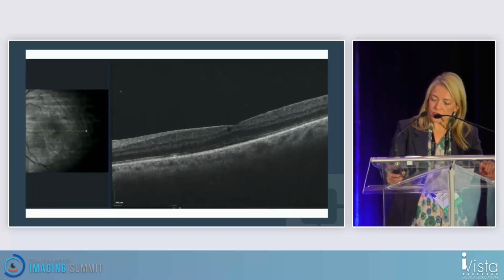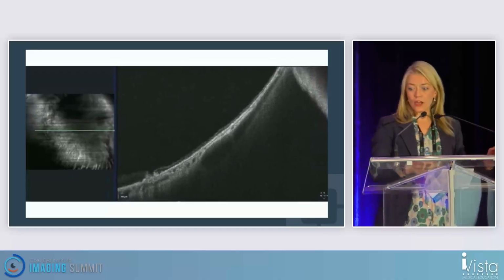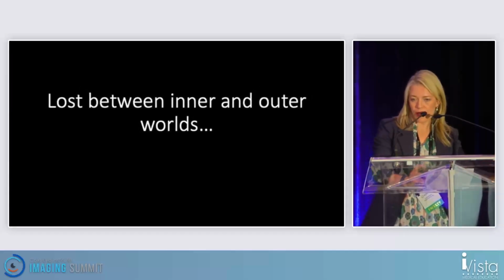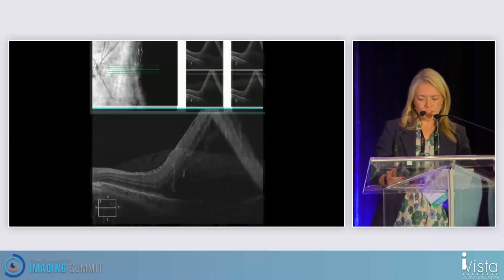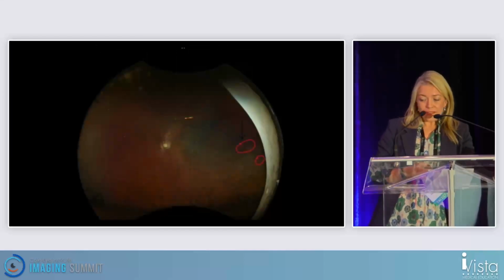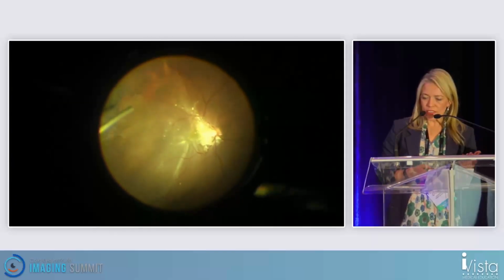This is the macular OCT, and then in the periphery you can see the laser that we did. This is the very thin inner retina where there was a large outer retinal defect. Now sometimes it's not so easy, and this is a patient who also had schisis detachment, and also had an ERM, and everything looks a little chronic. You wonder if there's a little PVR. This doesn't look very healthy, and then we thought there was maybe an inner retinal defect, but in surgery, nothing is moving. You're not getting that Schlieren. You're really kind of lost where you're going to drain from.